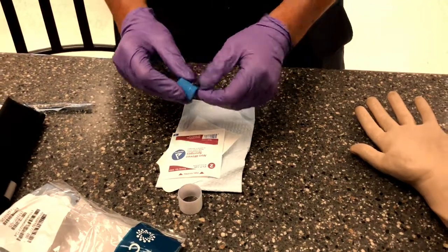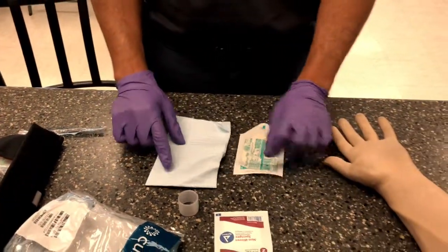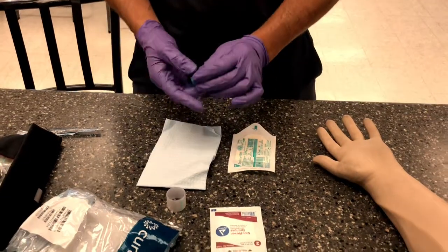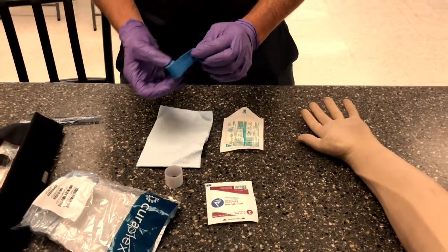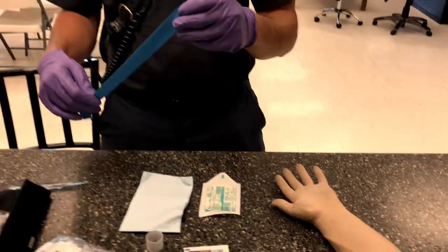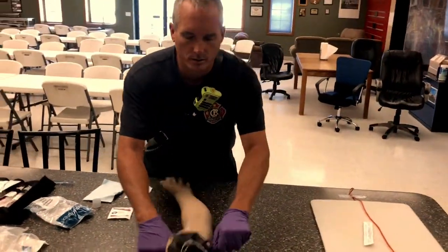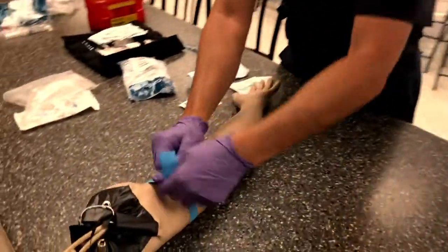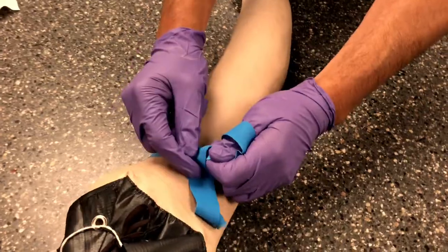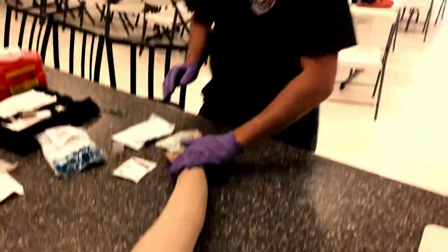We have our tourniquet, our 2x2, our Tegaderm, our towel, and our tape. First thing we're going to do is identify on the patient which arm we want to use to start. And I always stress start high on your tourniquet. We'll get that on good and tight. Just tighter is always a little bit better, so we can get a good fill on these arms.